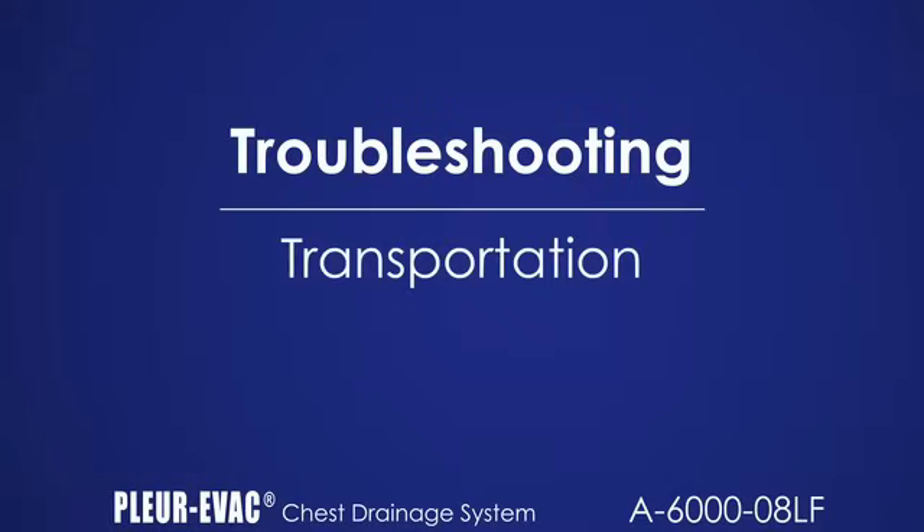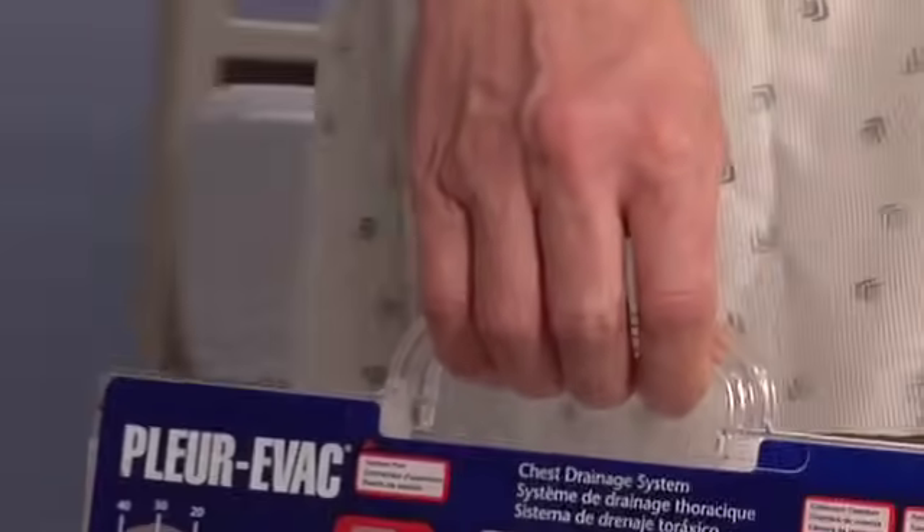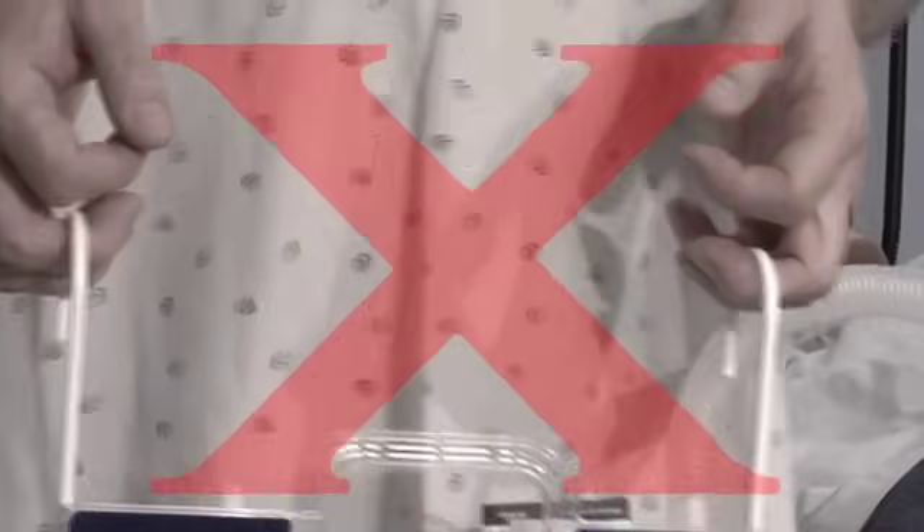Keep the unit upright and below catheter level. Do not tilt the unit to a parallel position. Carry the unit using the handle on top. Do not use the two hangers on the side of the unit to ambulate the patient.